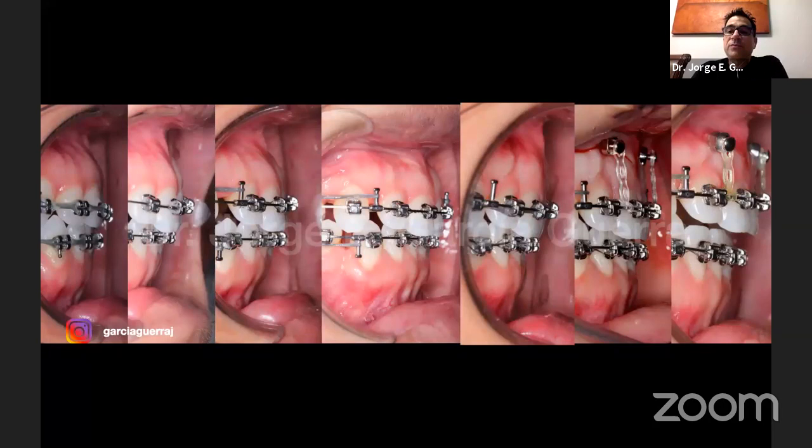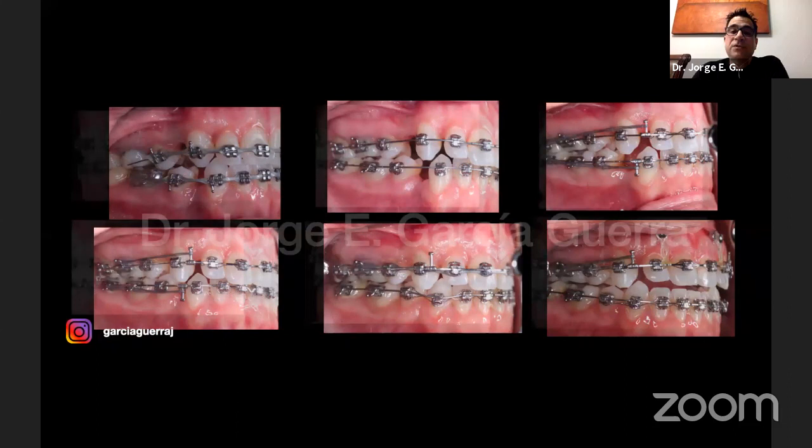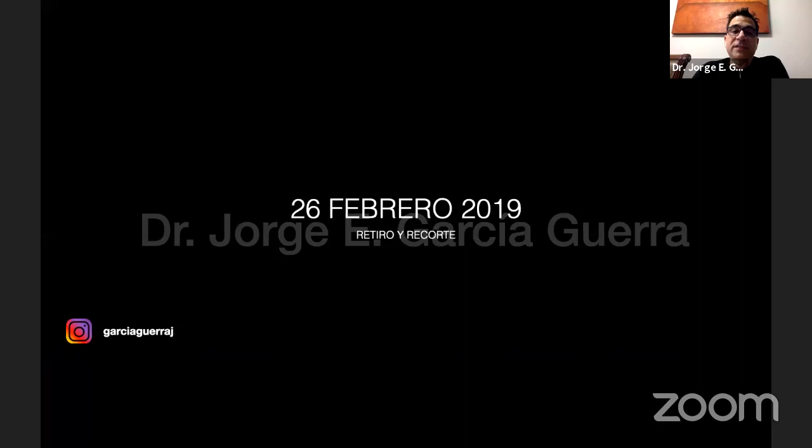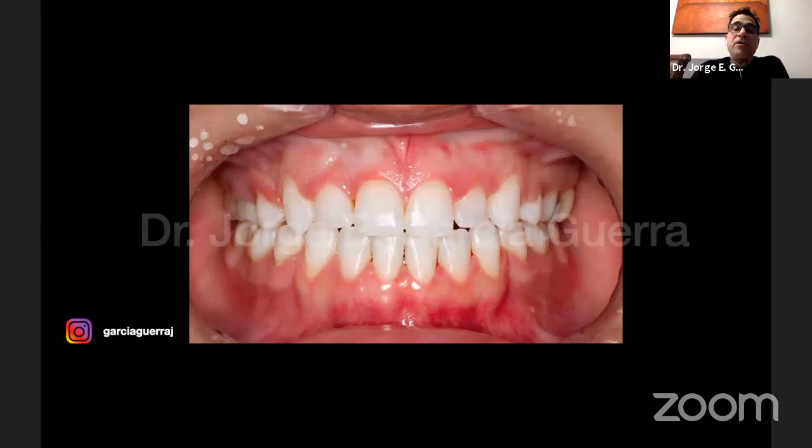And here's some progression. I'm just going to go fast here. Usually this lecture is about 3 or 4 hours long, but we're going to try to do this a little bit faster. Now we took the brackets off. This was last year, and you can see that we have a better incisor position there.